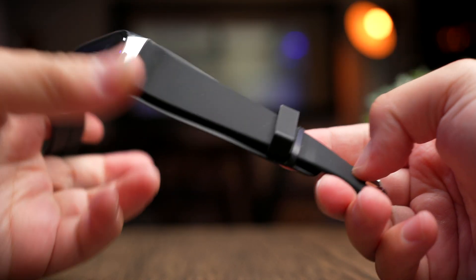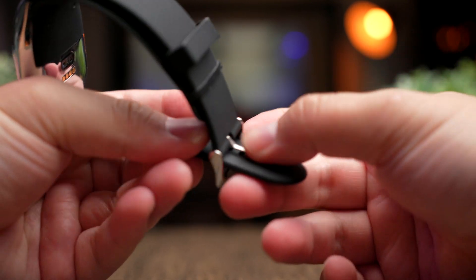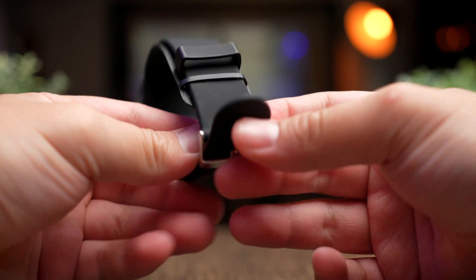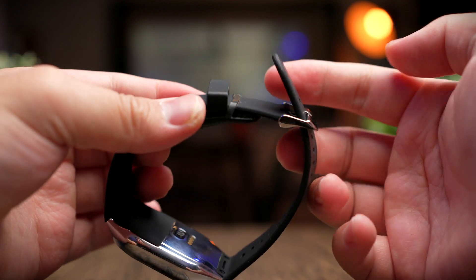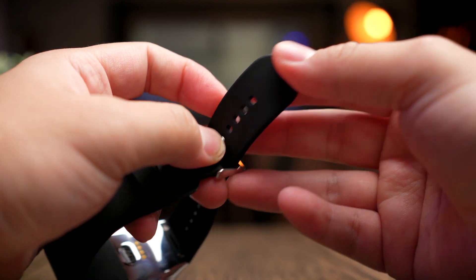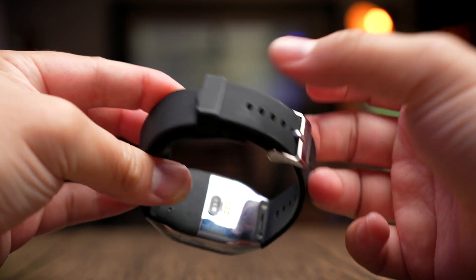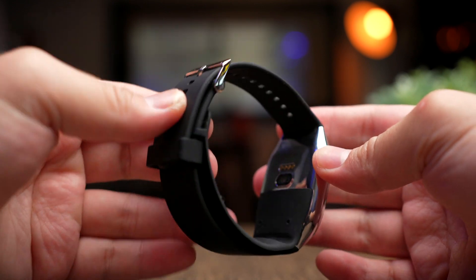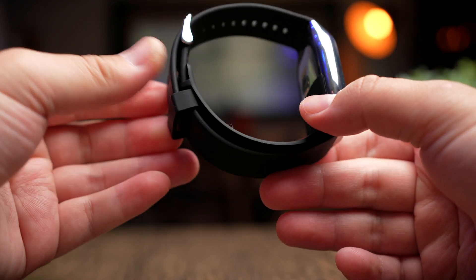Another issue I noticed: if you have very large hands and use the last two or three holes, there's no way to slot the strap end back in — it ends up flapping open. Only at the fourth or fifth hole can you properly secure it. I think this would be addressed if you were to flip the strap.